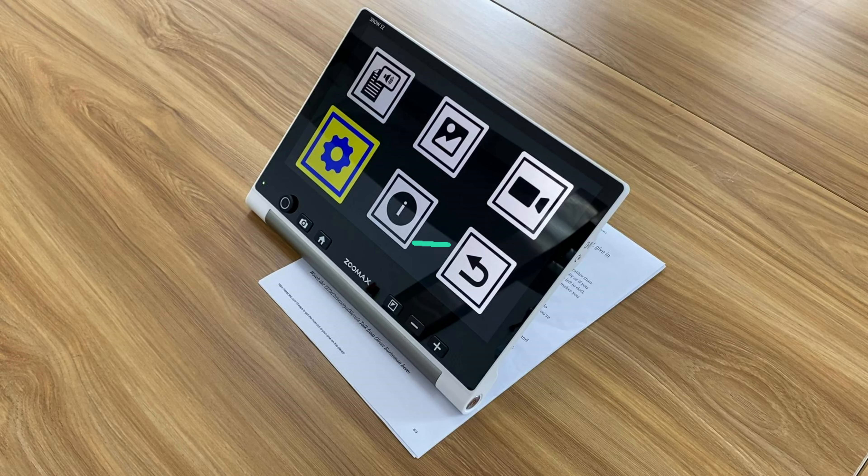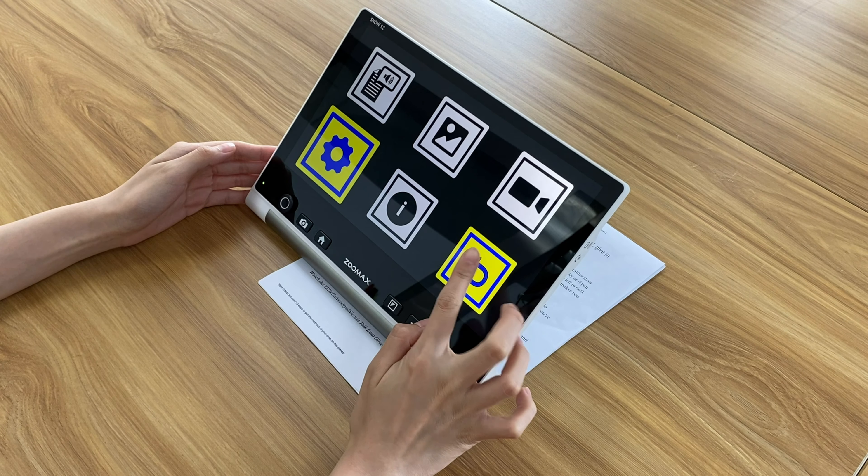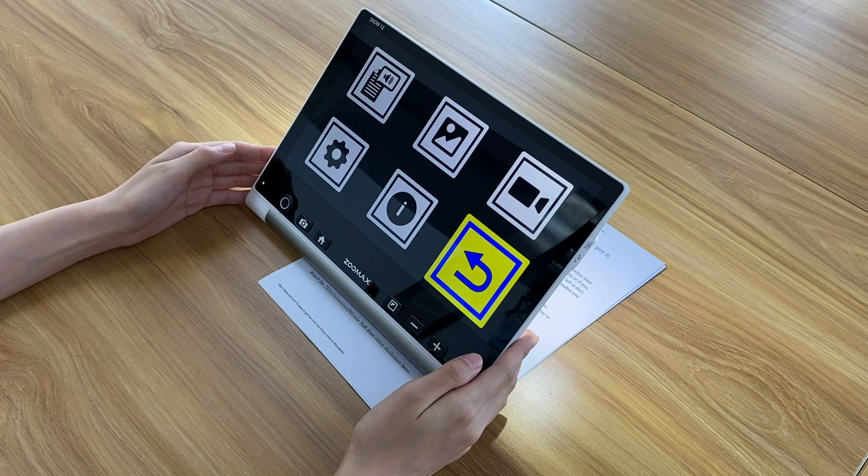This system information icon records the information of the device, commonly you don't have to use it. And the last icon is to exit the menu.